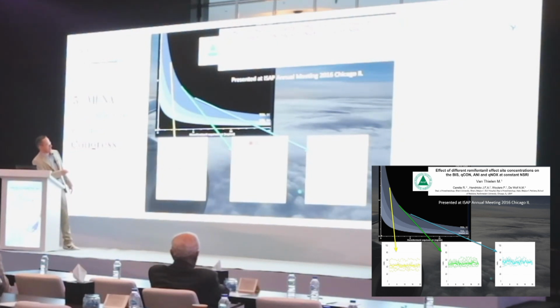And this study shows you that the BIS in all 3 groups remained between 40 and 60. So it's safe if you use synergy to reduce your hypnotic concentration by 50%, as we have seen from the article earlier on.